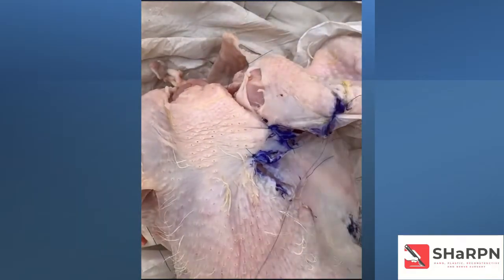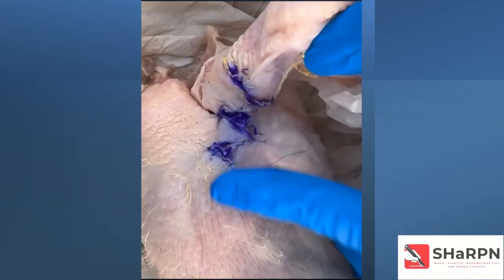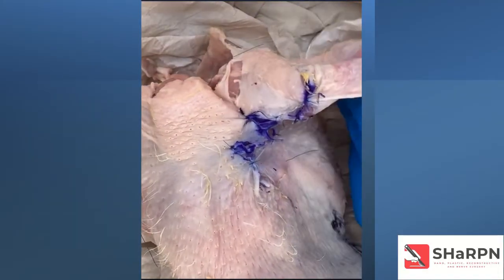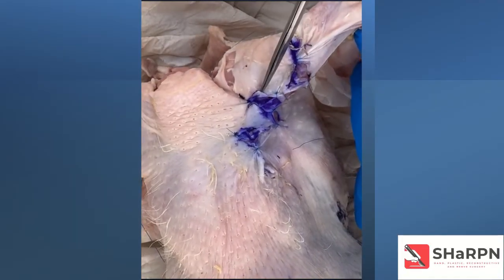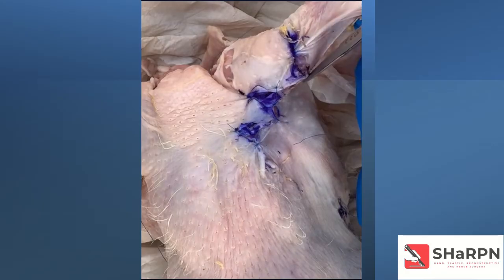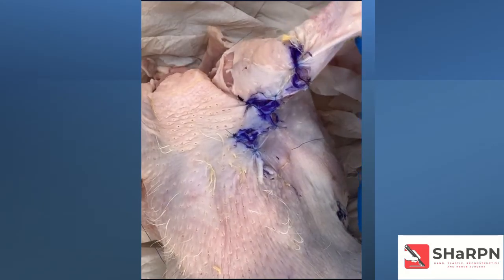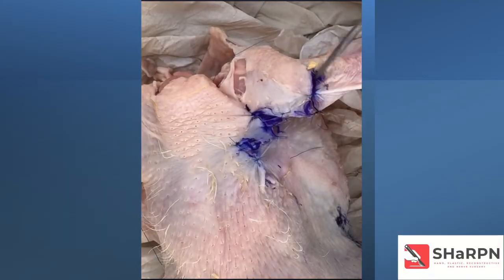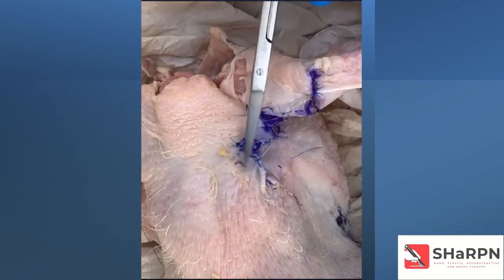Once we've sutured all the flaps in, we can see that the tenting across the axilla is now down and the chicken has free abduction of the arm. Now, the important thing to note with these flaps is because flap C and flap B move 2 flaps across, they're essentially a 90-degree transposition.